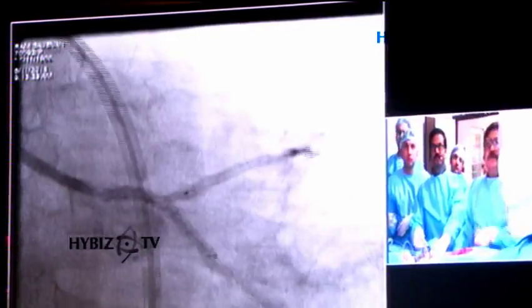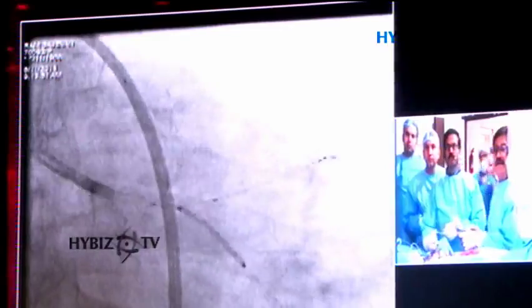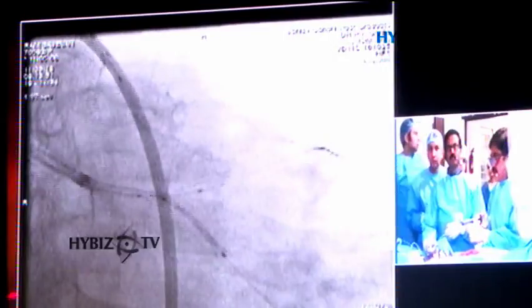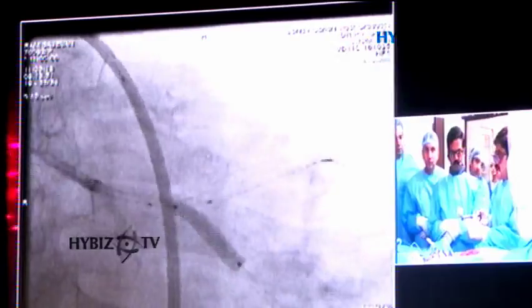Angio, please, come on. I think I need to push this stent slightly. Is this the stent? So that's the stent. I have a balloon on the side to crush this. And usually the crush will be a very small segment, if I'm not wrong.